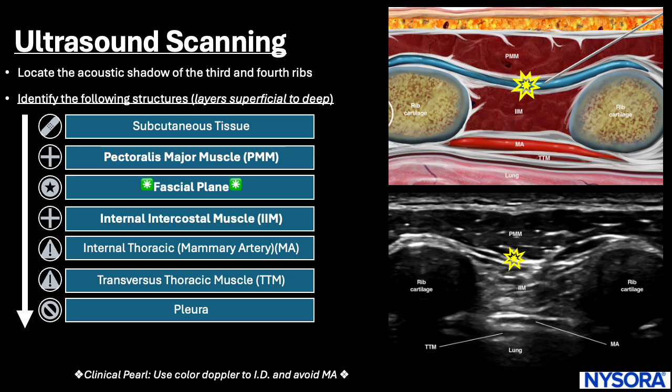A quick clinical pearl before inserting the needle. Activate color Doppler to further identify and avoid the internal thoracic artery or mammary artery, reducing the risk of vascular puncture to this structure.